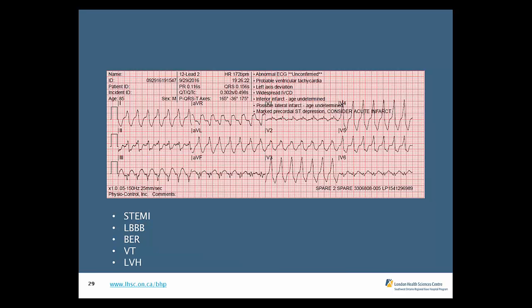Any thoughts, Matt, for the people that identified it correctly as VT, the next question is, do they have a pulse or not? And that'll decide our treatment from there. But if there's a 12-lead ECG, I hope they have a pulse. I just thought he was quiet.